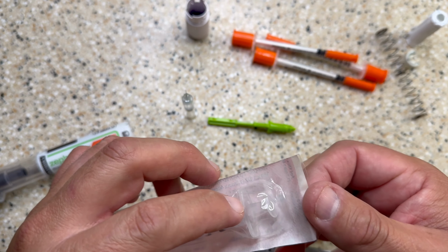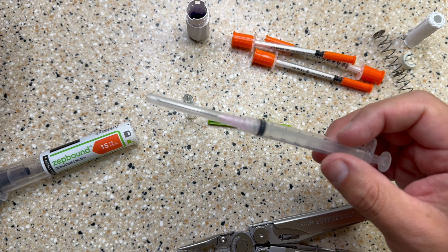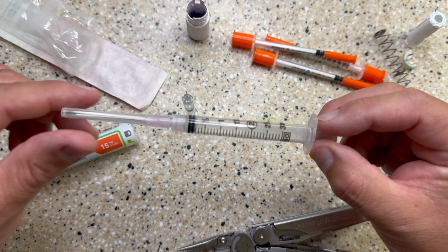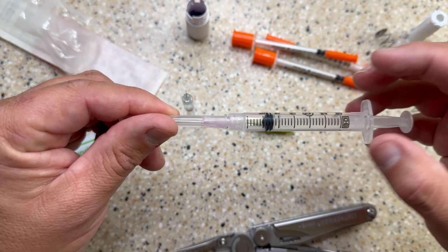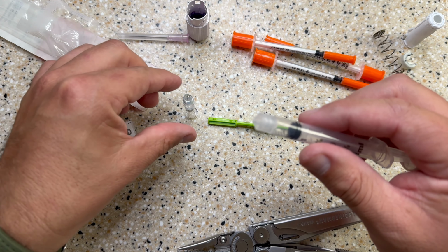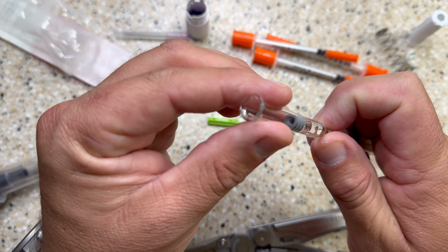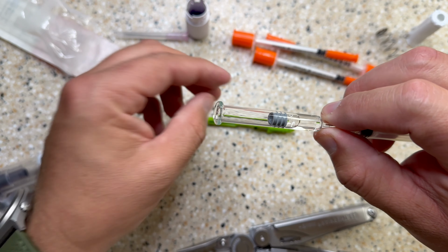So, brand new sterile packaging. Because the contents of these are 1/2 mil, you really only have to pull this back to 1/2 mil, as you can see right here. And so we're going to take out the needle portion, insert very carefully. So it's in there. And I'm just going to hold these together.